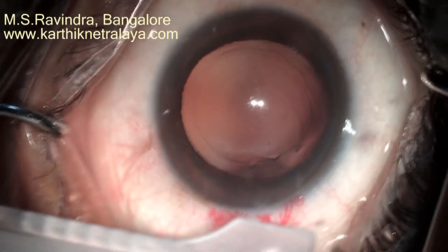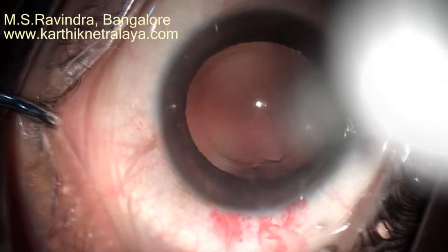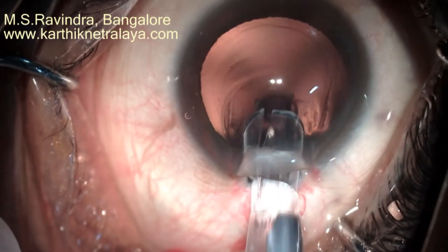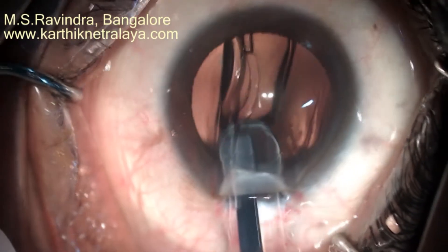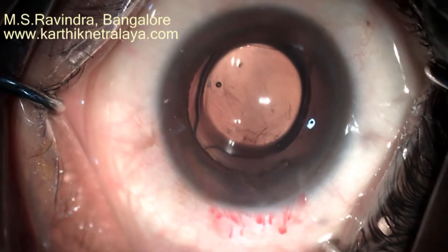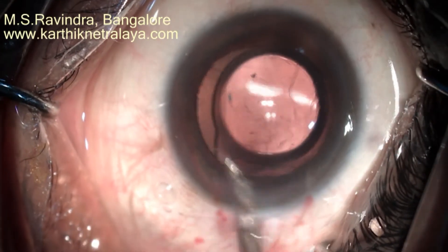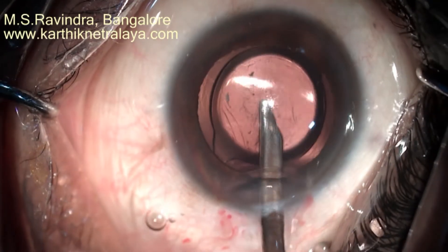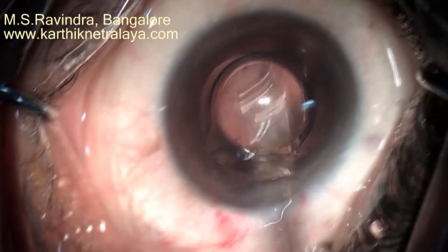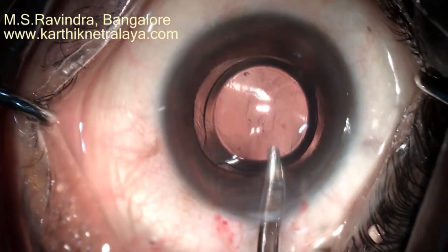A modified IOL pusher is used for lens insertion. Note that the cartridge is slid on top; it opens up as the lens passes through, reducing resistance as the lens moves through the cartridge. Visco is completely removed from the capsular bag, from behind the lens, in front of the lens, from the angle region, and from behind the endothelium — minimizing the postoperative pressure spike.